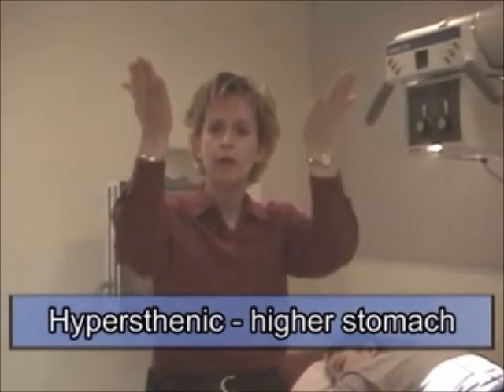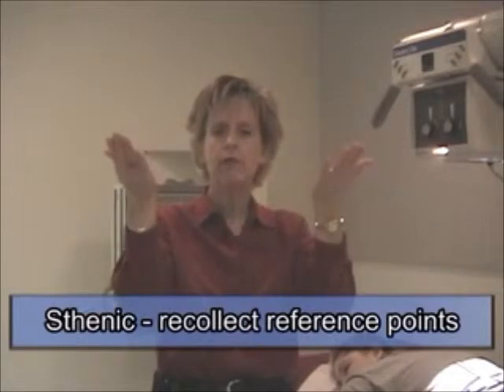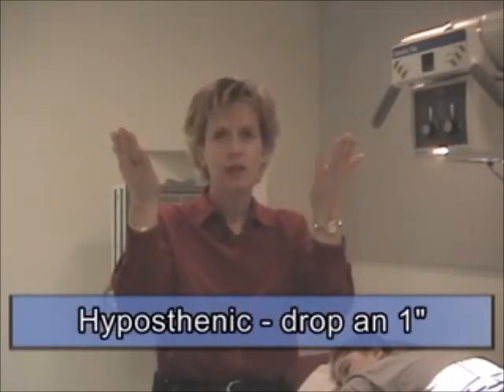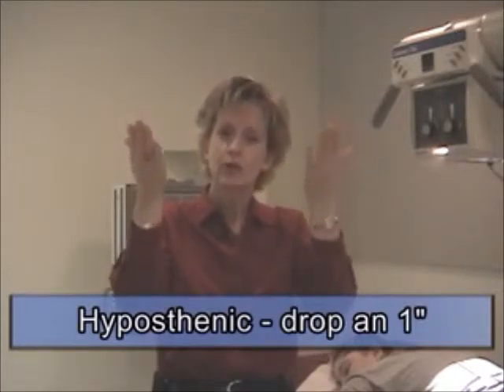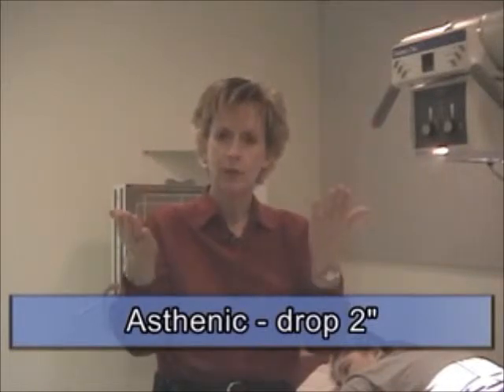Again, don't x-ray tabletop, the side-to-side method. Okay? So, hypersthenic patient, the stomach is higher, center a little higher than normal. Sthenic, we're making you memorize those part film reference points for the sthenic patient. Hyposthenic, just under average, so you drop down 1 inch, and asthenic, you actually drop down 2 inches. Okay? Hypersthenic, hypo, and asthenic in 1 inch increments for the different body habitus.